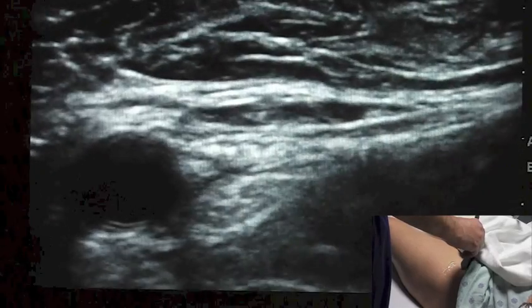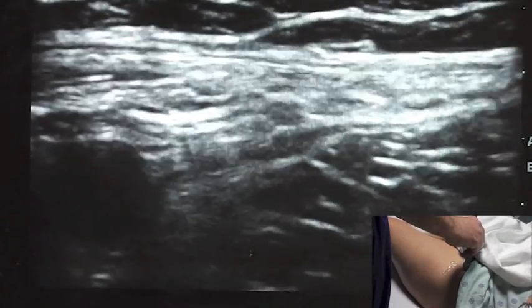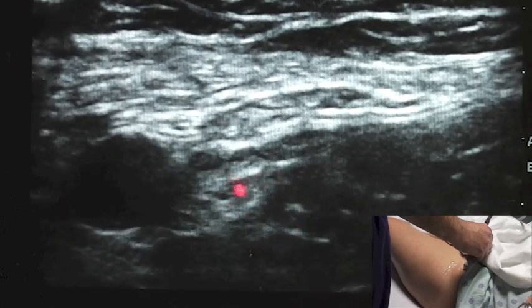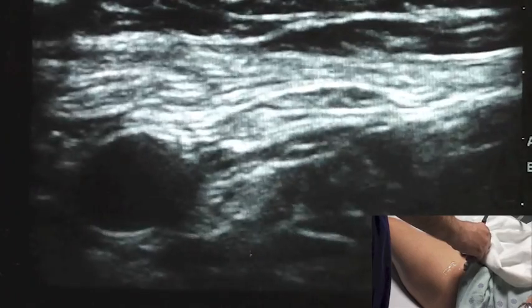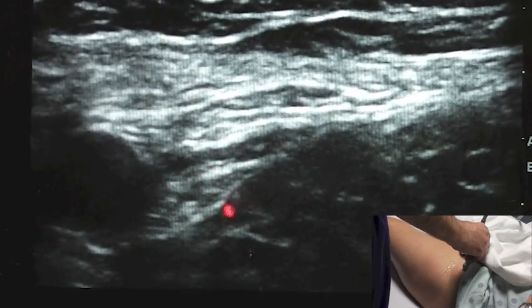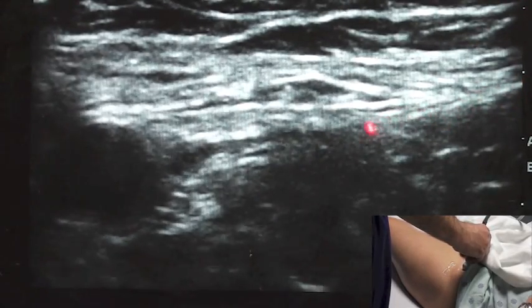I'm just going to gently rock my probe. Notice how the image changes slightly as I do that — this is a much poorer image, and as I gently rock backward, I get a much better image. I strongly suspect that our femoral nerve is sitting right here, just lateral to the femoral artery. One of the reasons people have failed blocks is that they don't appreciate that the femoral nerve sits just underneath the fascia iliaca.